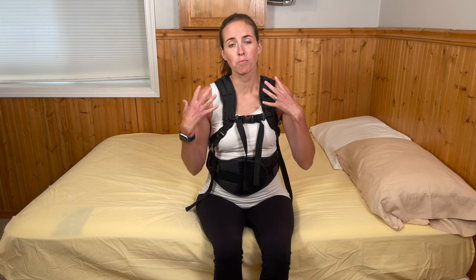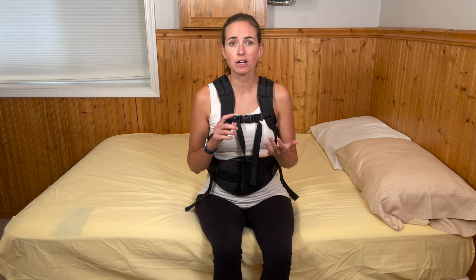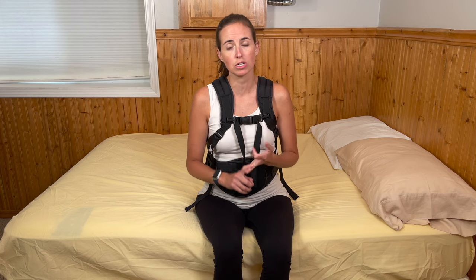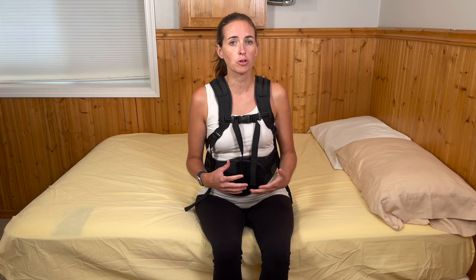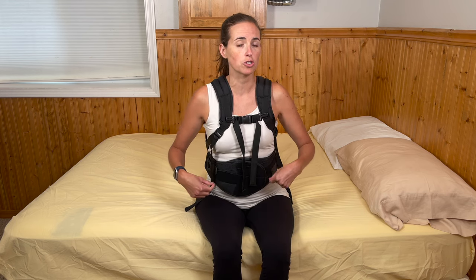Hi everyone, it's me Lindsay with EquipMeOT here today to talk about brace management and more specifically how to manage a back brace. These are commonly used following various back surgeries, procedures, or injuries and the one I'm wearing today is not the exact brand but a very similar brand that is commonly used for a thoracic or lumbar surgical procedure.